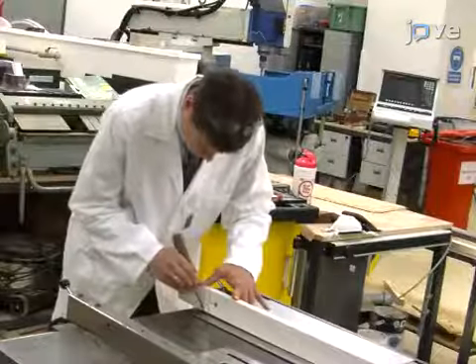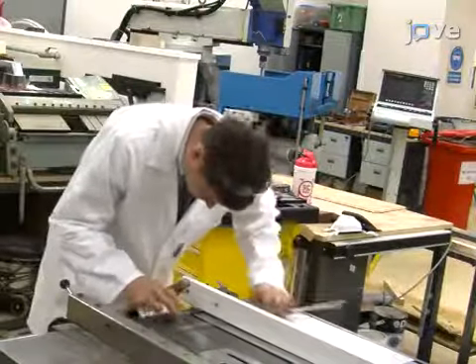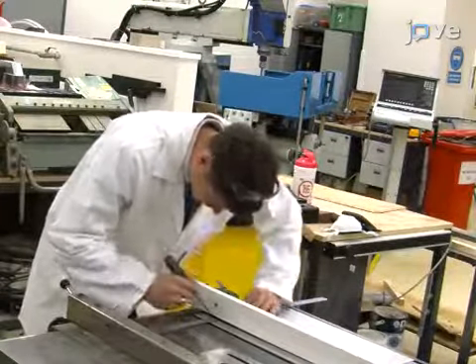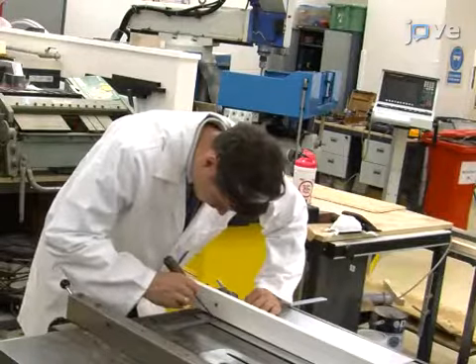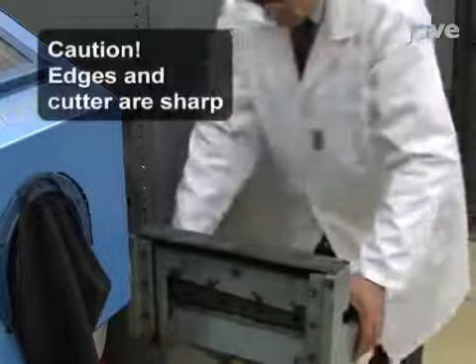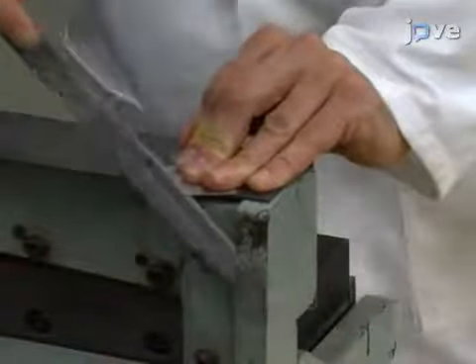Before sandblasting, use a ruler to draw a 40 by 40 mm square onto a 1.2 mm thick 316 stainless steel sheet. Then, use a manual metal cutter to cut out the square and use a file to round the corners and sides of the sample.